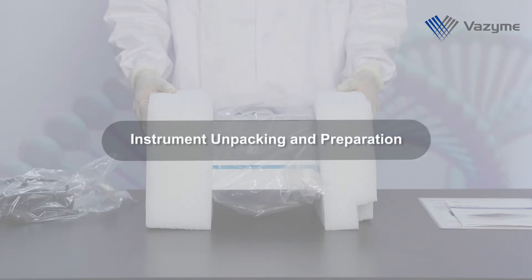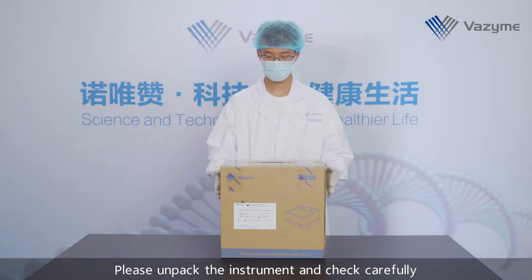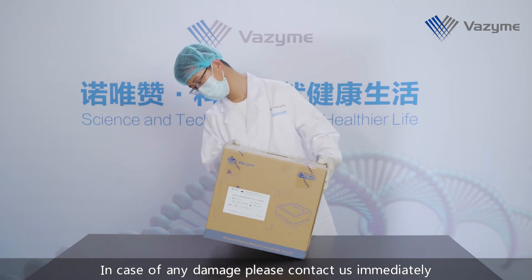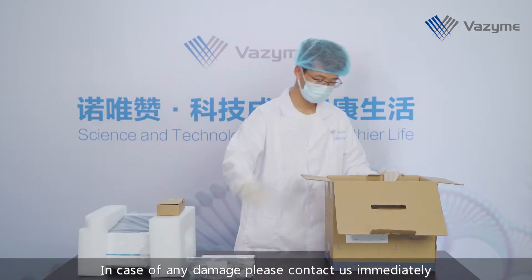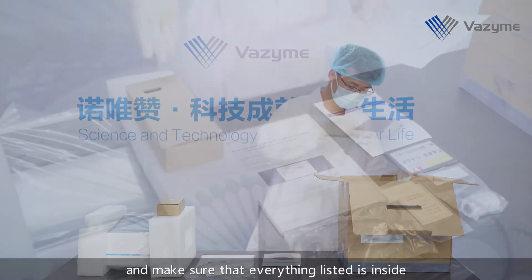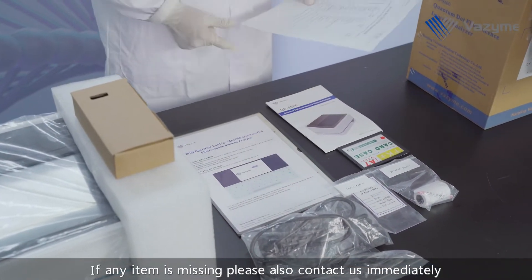Please unpack the instrument and check carefully. In case of any damage, please contact us immediately. Please check the packing list and make sure that everything listed is inside. If any item is missing, please also contact us immediately.